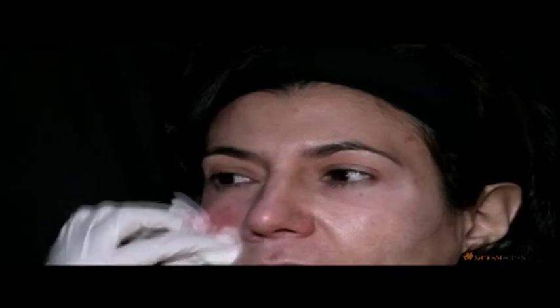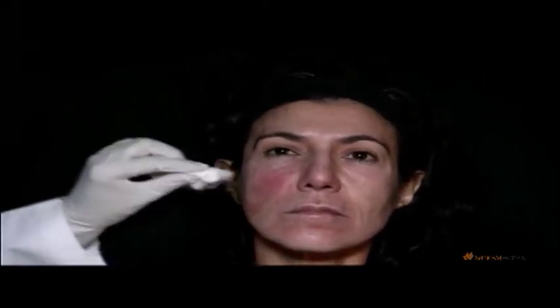So now I've injected into the midface, I've injected a bit into the temple. Let me show you the pre-jowl sulcus. And of course, it's nice to see already that she's got an awful lot of cosmetic effect with relatively little product. So that's kind of an economic advantage for the patients. When we mix the Radiesse with lidocaine, what we're going to get is about 1.3 cc's total. And at the moment, I've used 1 cc, so that would not even be 1 syringe.